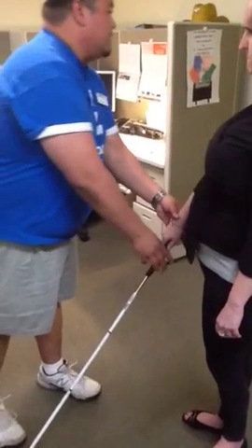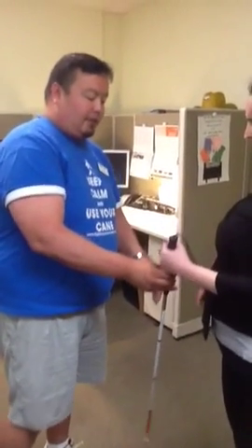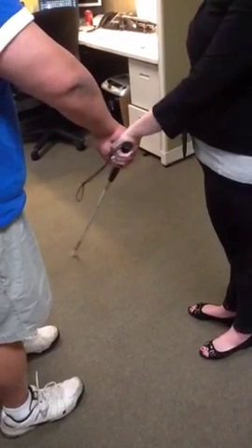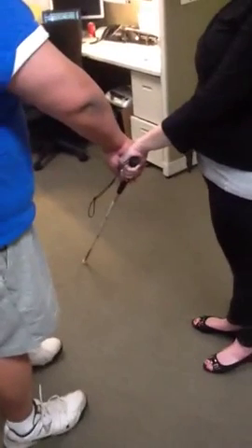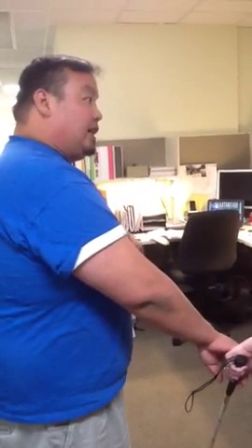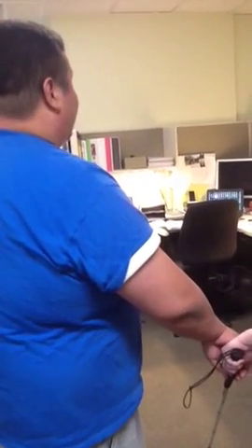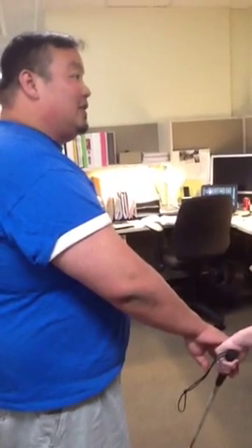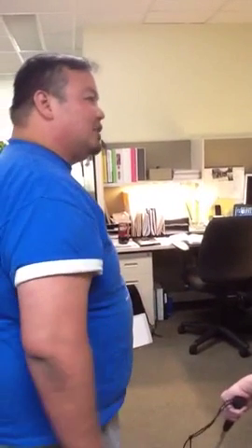Okay. Now, when we go into the right, because you're using the right, one thing that you can do is switch sides. I know that might be a little weird right now, but you're going to use diagonal, and the tip is going to ride the edge of the wall. So you could walk along the wall, and as long as it's right at the tip, you know that you're going in that direction. The other is you understand that at no point in time you'll get lost, because the wall will always be there. Okay. Please do not lean up against the wall, because the last thing you want to do is get past a big space and fall into that space. So you want to leave about an inch off the wall.